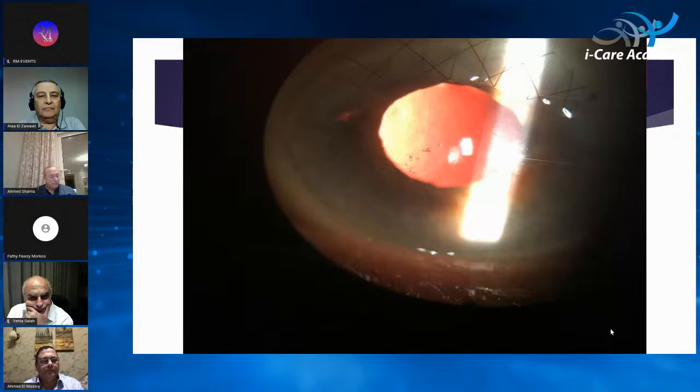It's like the minute when you are creating a flap during the LASIK, and you tell the patient you will go blind in seconds because there is no circulation, no electricity at the back of the eye. So it was unfair to measure the electrophysiology when the pressure was above 60.